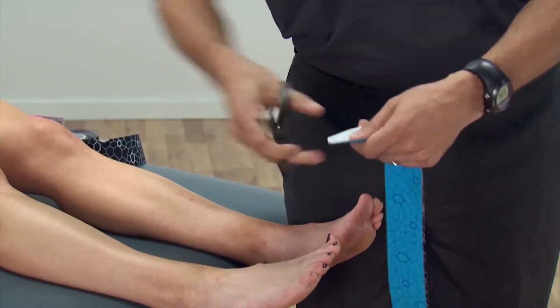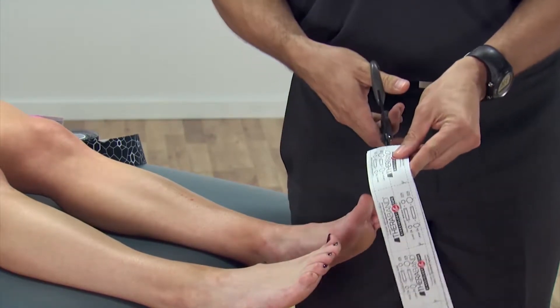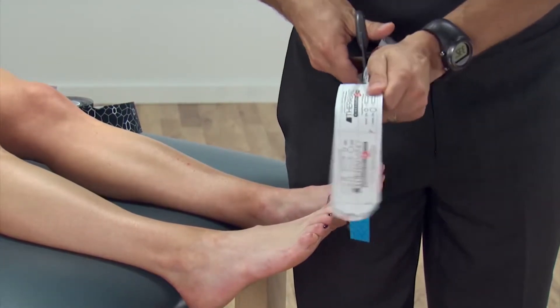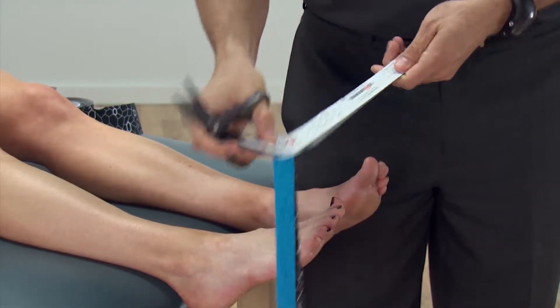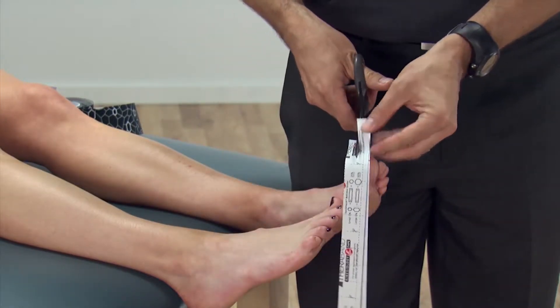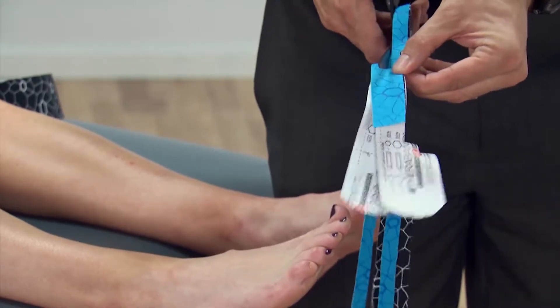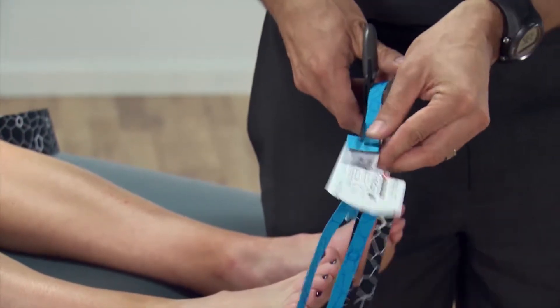We're going to round our edges to make sure that we can avoid catching the corners on clothing. We're going to hold our two strips together, cut in the middle — the TheraBand kinesiology tape actually has a dotted line right up the middle making it easier to find 50% width — and then 50% of each tail. There's also a shortcut: just fold the tails up on themselves and cut right in the middle, and that will give us our four strips.